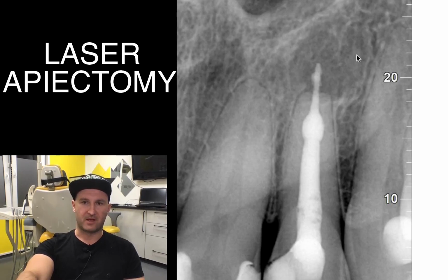So the patient showed me her RVG photo X-ray, which was taken by her dentist, and this is where their dilemma started, because they were not sure if there is an inflammation process visible on this picture, and patient in fact was not complaining about this teeth.